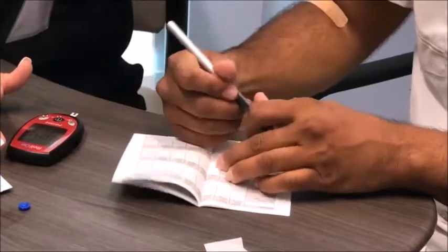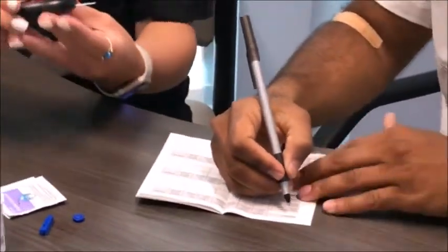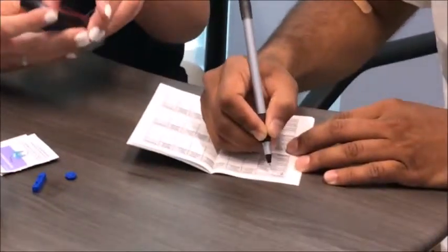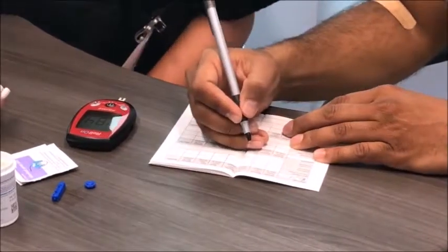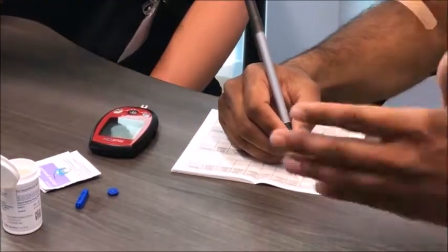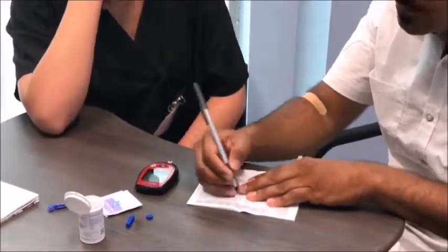So today is the 5th of August. Some monitors, like this one, have the date and the time on them, which is really nice because it helps you when you're logging it, except this time is wrong. It's 11:50, not 9:50. I haven't had breakfast, so this would be before breakfast. And it's 184.